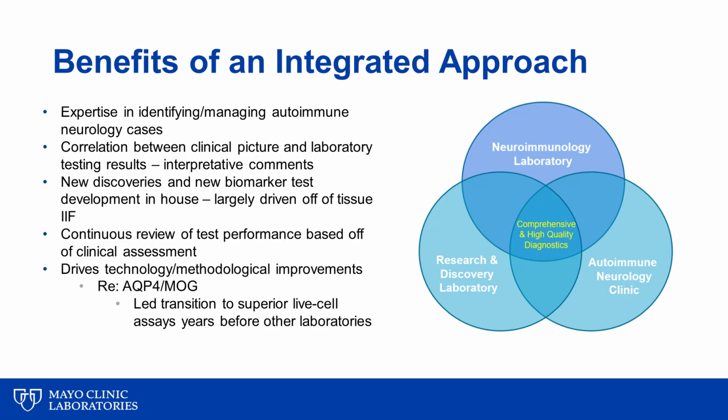One benefit to this approach is the identification and clinical definition of samples that are used in these competency training programs, as well as being used as part of our test development process. This integrated approach also allows the laboratory to customize and provide clinically relevant interpretive comments that are vetted both by the laboratory as well as clinicians. This approach also supports the discovery of novel antibodies.